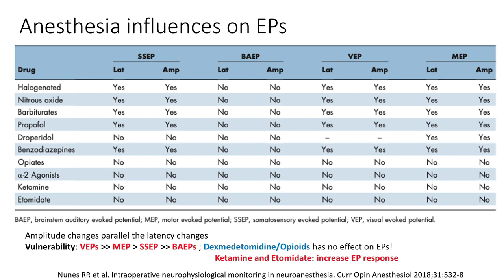Summarizing this, anesthesia influences and evoked potentials. The majority of anesthetic agents have an influence on evoked potentials. The visual evoked potentials are the most vulnerable to anesthesia influences.